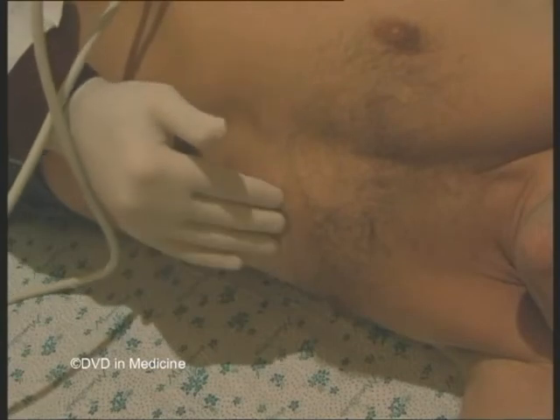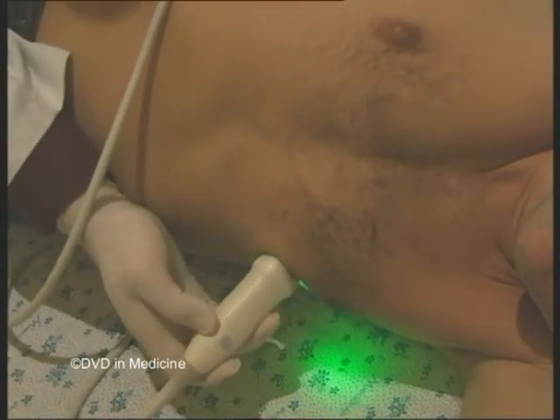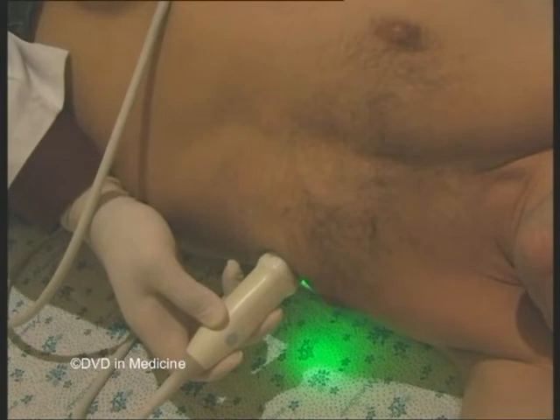Apical images. One should place the transducer in the area of the apex of the heart, and the scanning plane must be directed in such a way that one obtains the image of all 4 chambers of the heart. For optimal visualization, the patient should be put on his or her left side, and the transducer should be placed in the area of the apical impulse palpation.